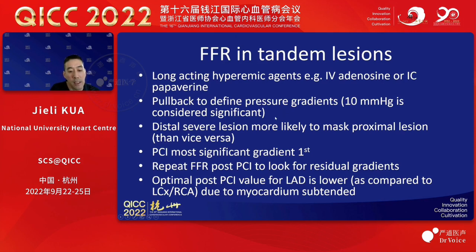Another thing to note is that the optimal post-PCI value for LAD is generally lower than that of the circumflex and RCA, just because of the myocardium subtended. So it's not uncommon that when we do an LAD physiology-guided PCI, at the end of the case you find that your FFR value is not as satisfactory as when you do a circumflex or RCA.